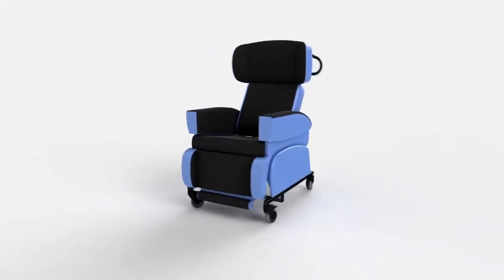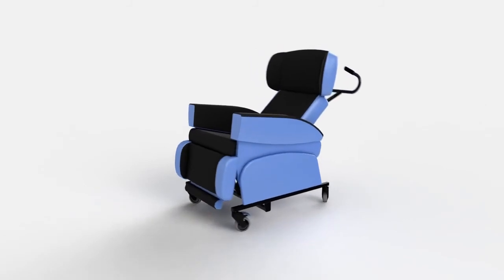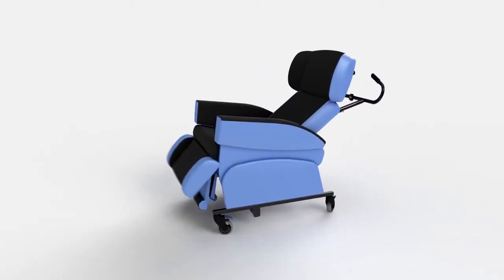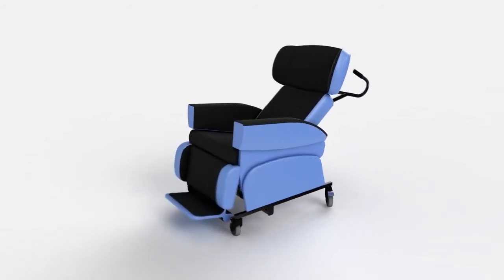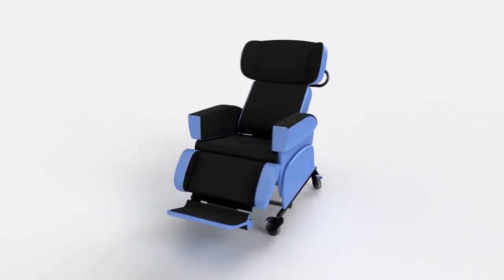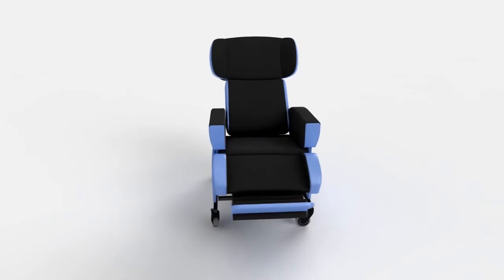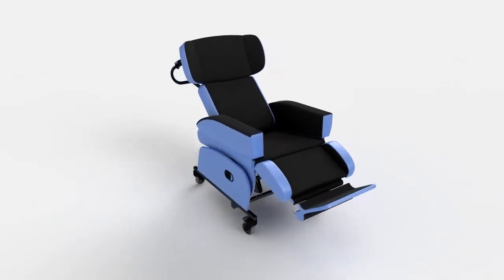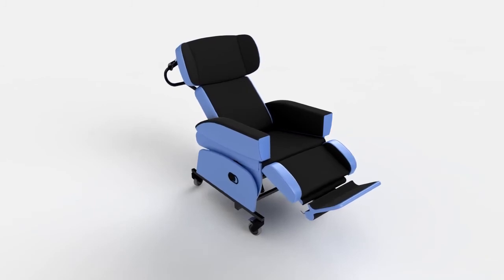The HydroFlex is ideal where total support is required to limit deterioration and provide a functional, comfortable, and energy efficient position. A fully adjustable chair that encourages a symmetrical and midline position. The type and position of support can be easily modified to suit the changing needs of the user, and offers total pressure relief.